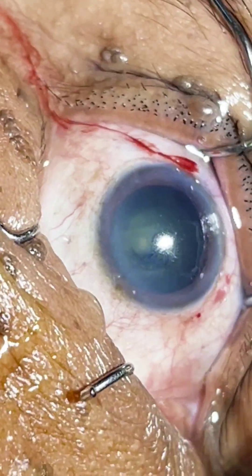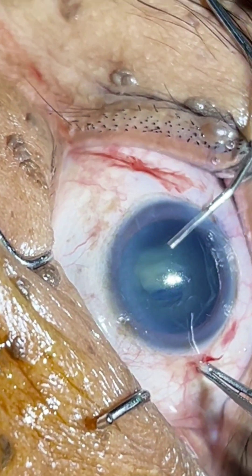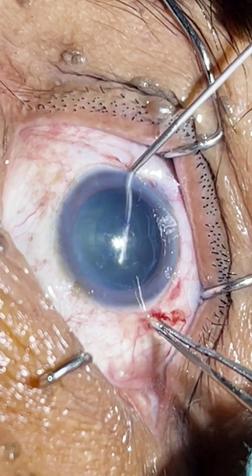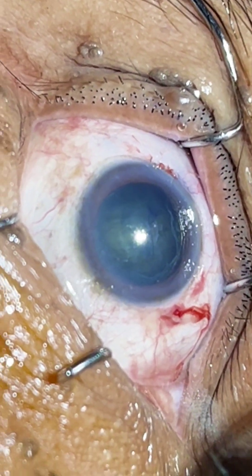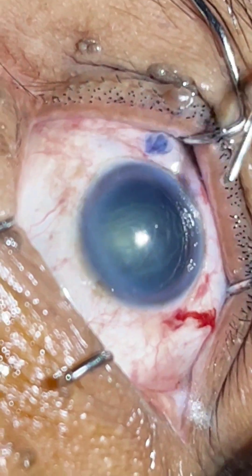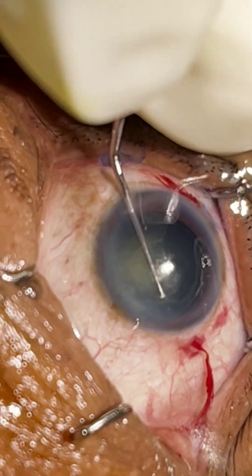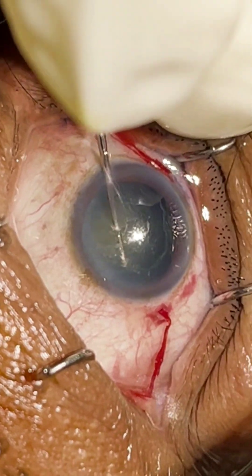So we are done with the rhexis. Now we will do hydrodissection. Now we will just dial the nucleus a little bit, and we will proceed with direct chop.